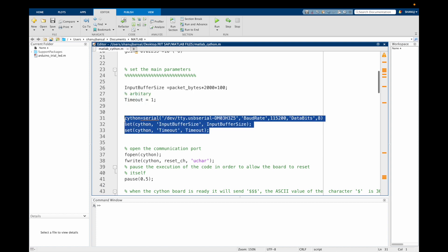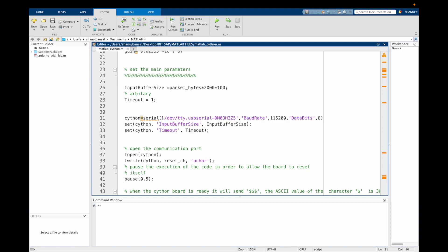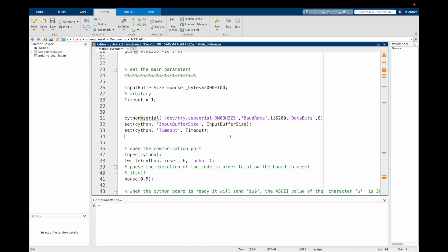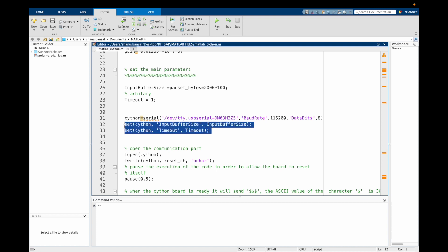Now we define the Cyton board serial object using the port name of our laptop. For a Mac, it may be something like this — you can find out using the terminal window on your MacBook. For a Windows system, it may look something like COM1, COM2, or whichever port you have connected the USB dongle into. We now set the Cyton board input buffer size and timeout using these commands.